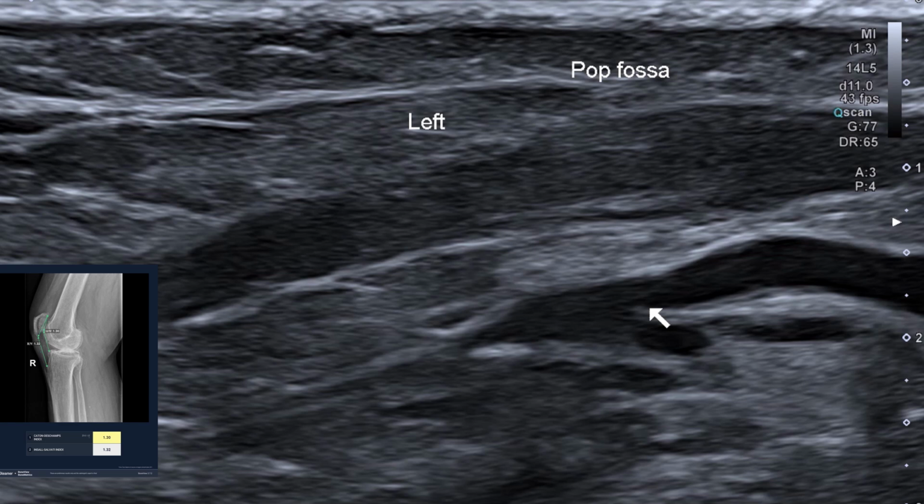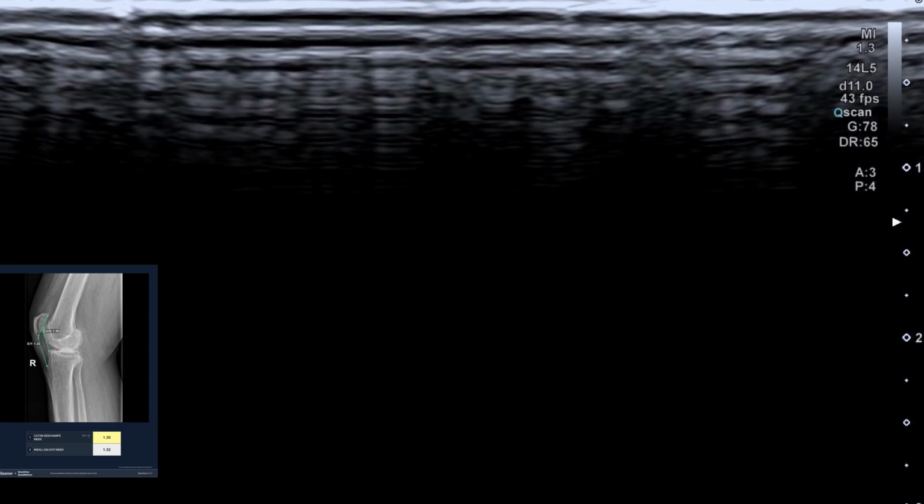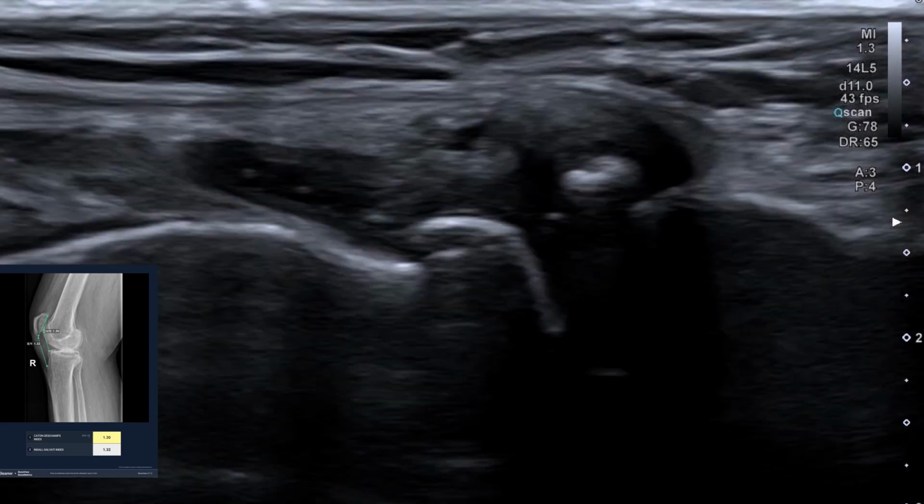So we have got a case today that we're going to tackle on a knee joint. I want you to spot the diagnosis, and then if we agree, let's agree. If we disagree, let's disagree. So this is an elderly man, he's now 68 years old, and this is what we saw.